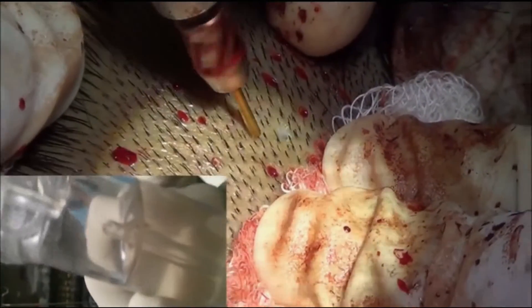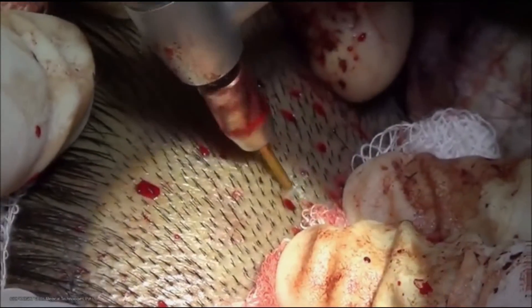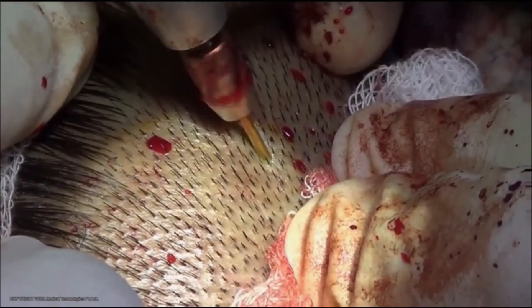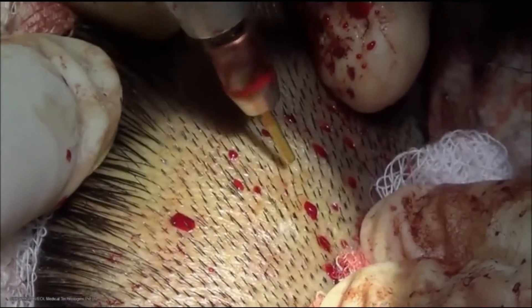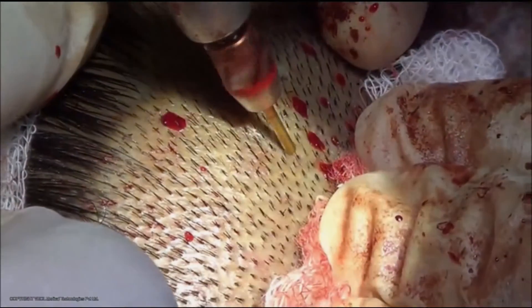As you can see, the harvested follicles collect in saline along with blood in the canister. Combined with suction, each follicle can be harvested in less than 5 seconds. This clip shows about 5 follicles being harvested in less than 20 seconds.